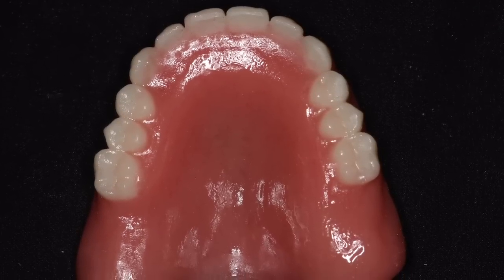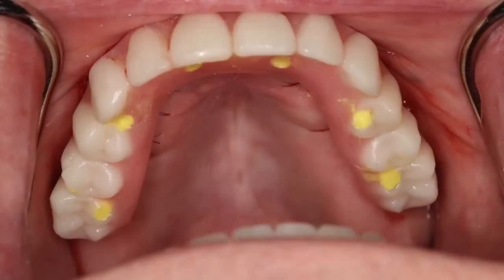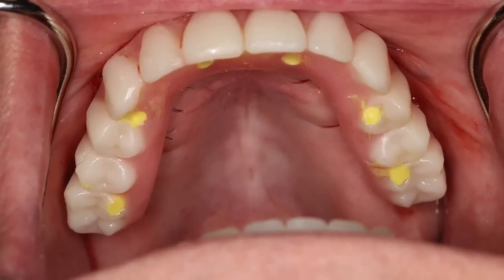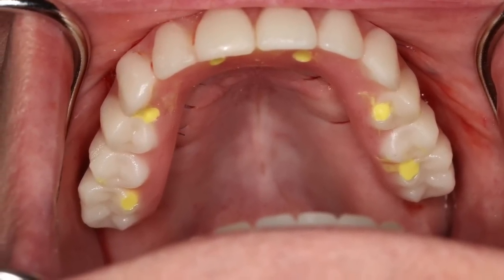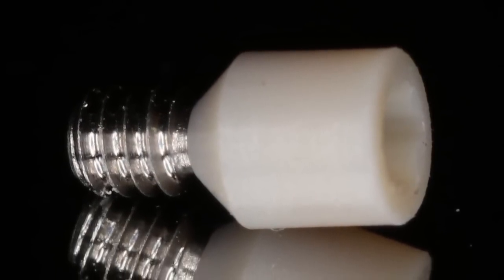This is a brief overview of how to take a denture like this and convert it into a fixed provisional restoration on implants without destroying the occlusal anatomy and the prosthesis in the process. We use separable fastener technology in order to accomplish this.